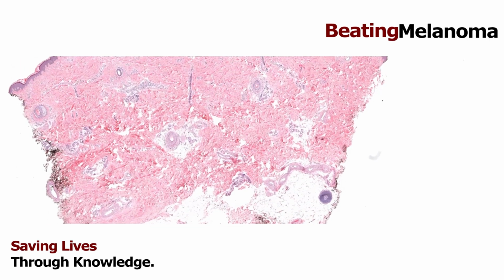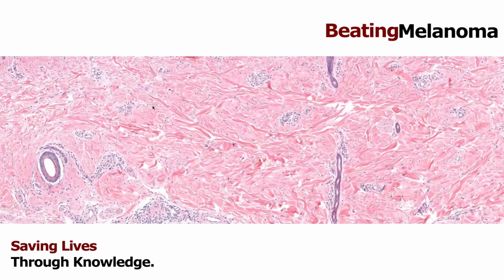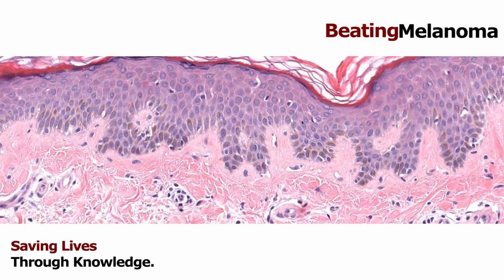So let's go in for a closer look. This is the epidermis up here, this purple layer, okay? And again, all of these cells, these are called keratinocytes, and their job is to hold on really tightly to each other and to keep the epidermis intact. So they're very strong. That's why if you rub your skin, it doesn't fall apart, because they're all interconnected like a meshwork, with big cables of keratin protein running inside of them. You've probably heard about keratin. Keratin is the stuff that makes up the center contents of all these cells.